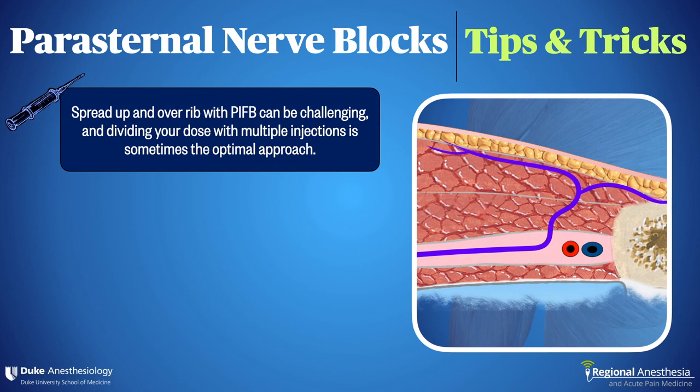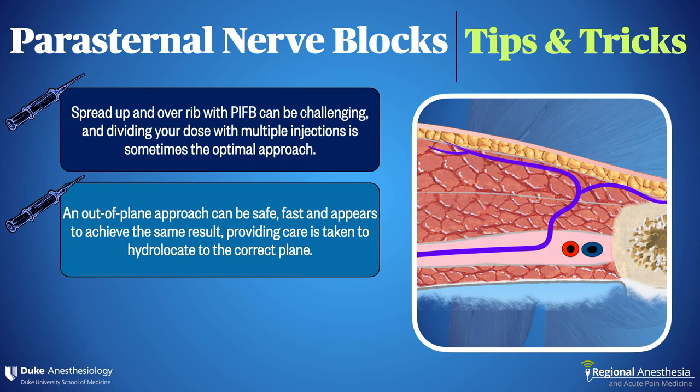There's little resistance to spread in this plane, and we find that single injections achieve excellent spread in most cases. Of course, this has to be balanced against the potential hazards of the deeper approach, including pneumothorax and injury to the mammary vessels. Overall, with ultrasound guidance, these blocks seem relatively safe, and one case series of 300 deep blocks demonstrated no serious complications.